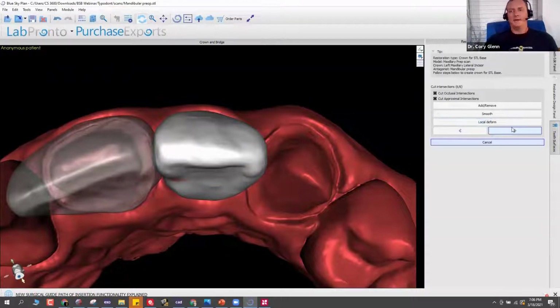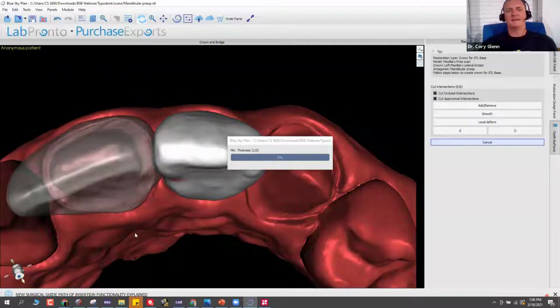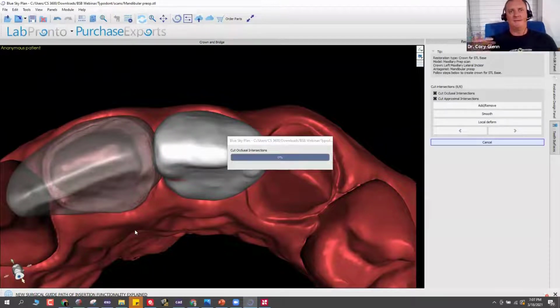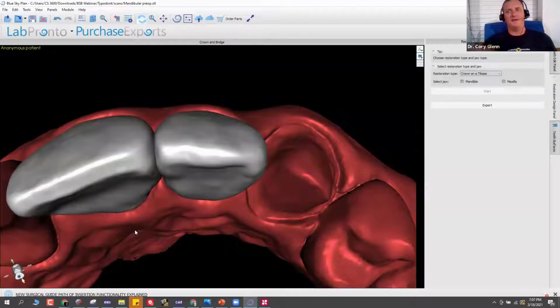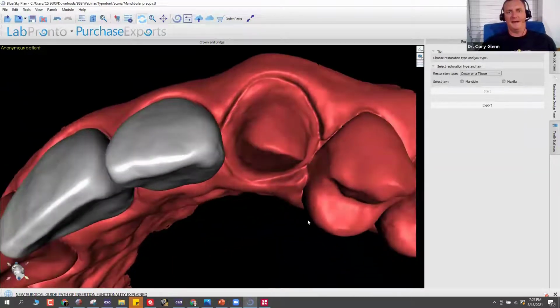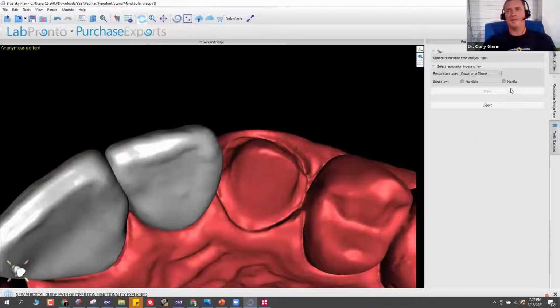I don't know what they are specifically off the top of my head. Since most of what I deal with is full arch work, pretty much everybody's getting A1. That's just for simplicity what I've done. But again, you could get online and see exactly what shades are offered.